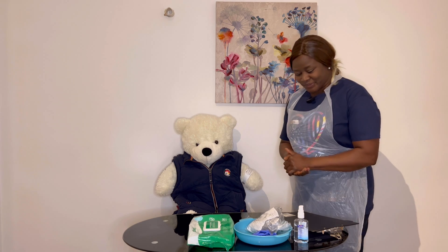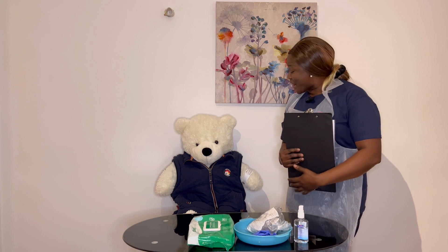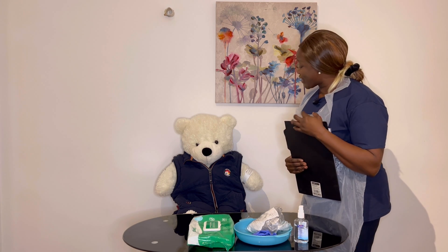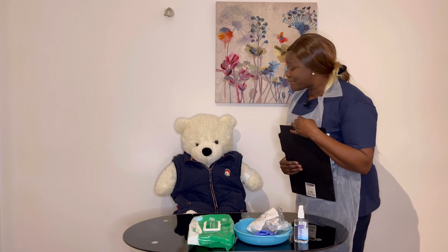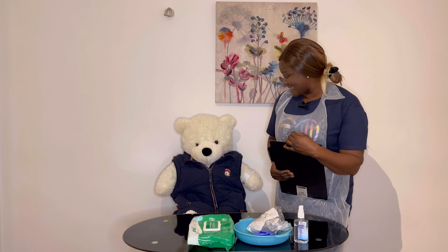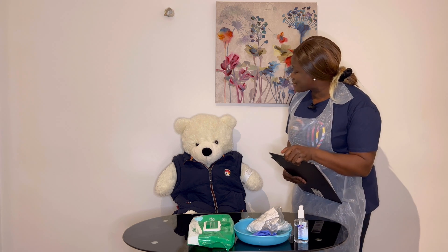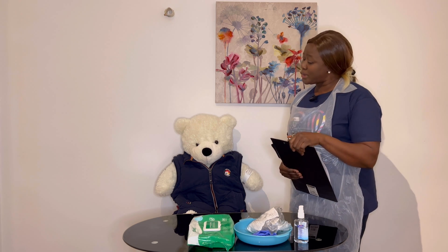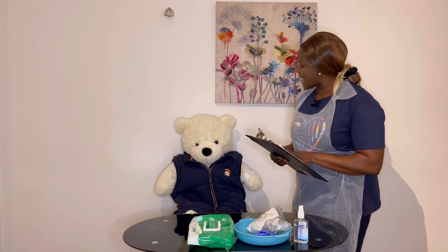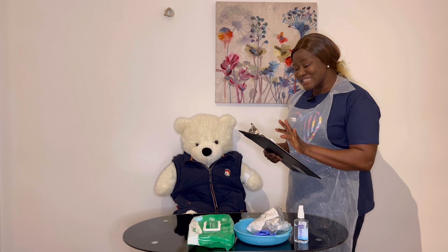Hello, my name is Ademola and I'm attending to you today. I'm here to give you the oxygen prescribed by your doctor. Are you aware of that? Are you happy for me to proceed? Wonderful. Before I go ahead, I would like to confirm your full name and date of birth and cross-check with the documents I have and your ID band. Is that okay with you?